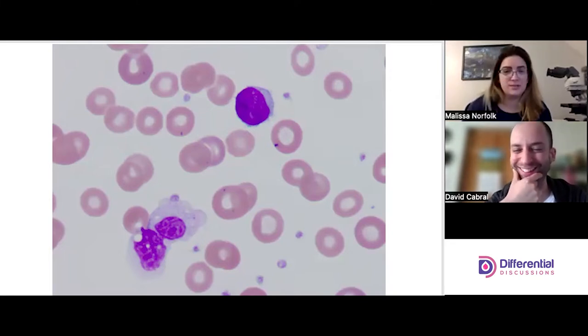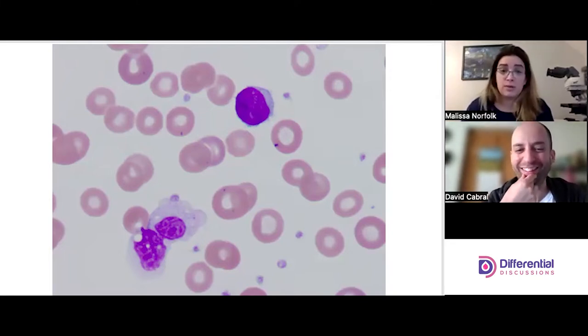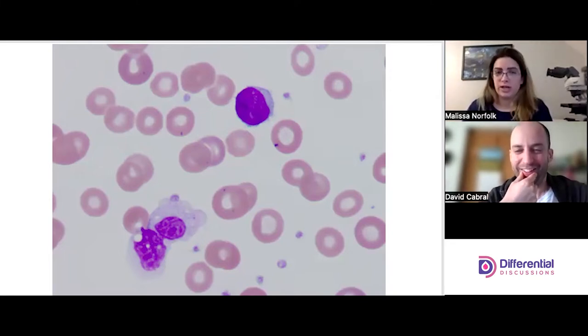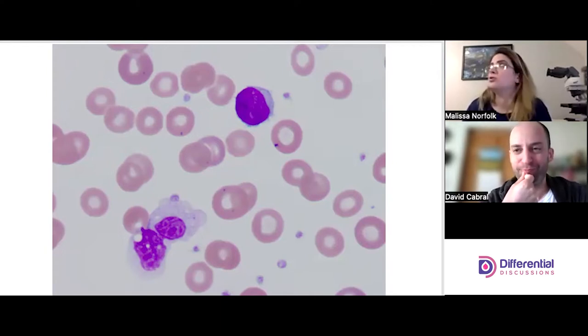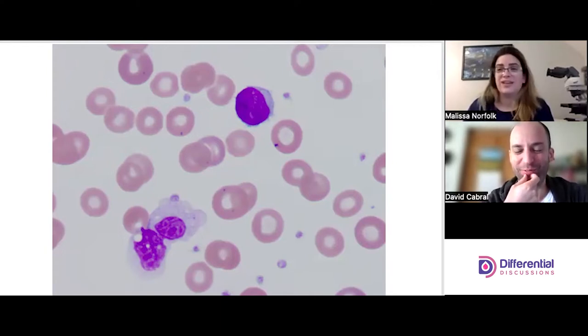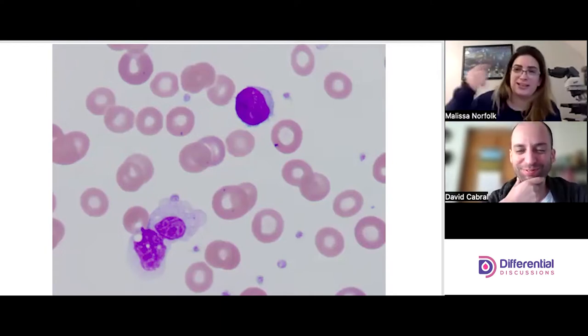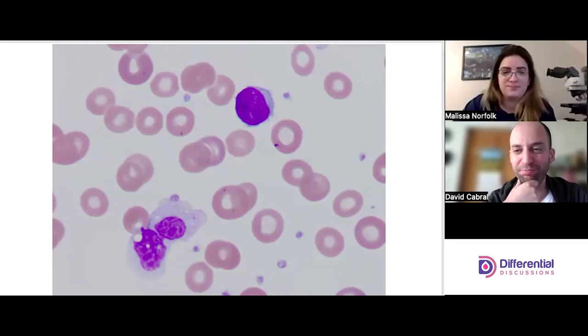Again, it's that checklist — you have to have all of the things together, not just that there are segments so it's a neutrophil. You have to have all the checklists in your head.